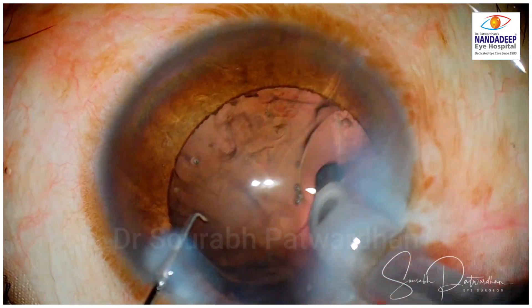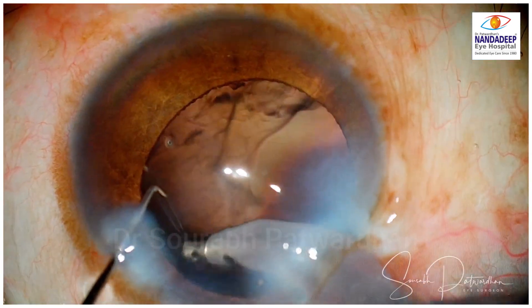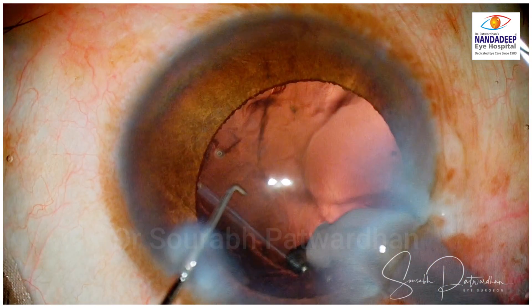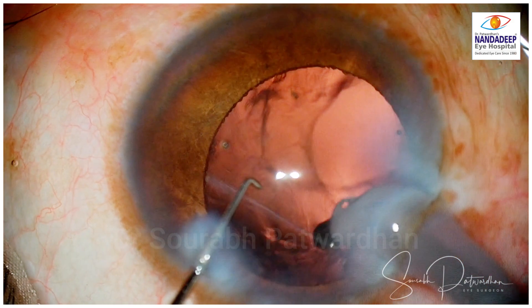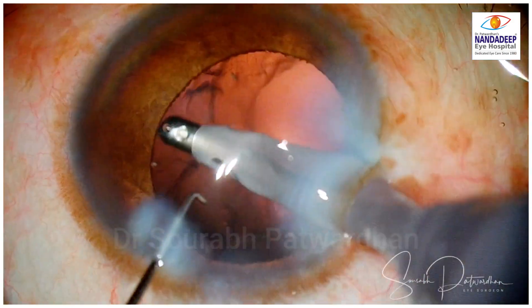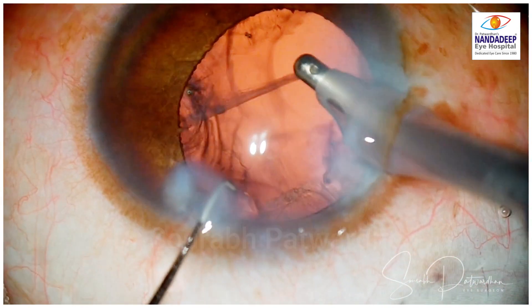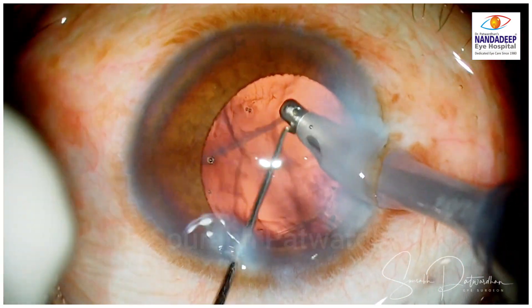Now we come to the quiz part. The nucleus has been removed and I am doing cortex aspiration. Watch carefully at this point — what is coming into the coaxial IA tip: is it cortex or is it something else? This is a very important image to understand, particularly for beginners, to understand the difference between cortex and — now you are clear — this is not cortex and it is coming from behind somewhere. That is a vitreous strand.